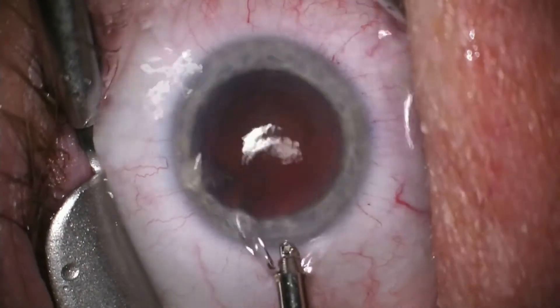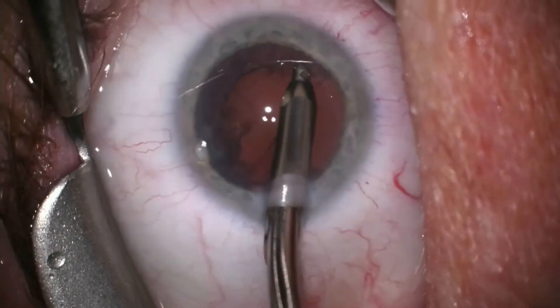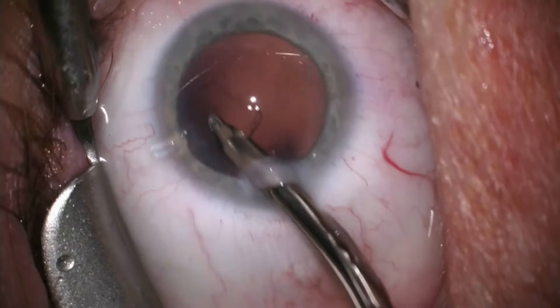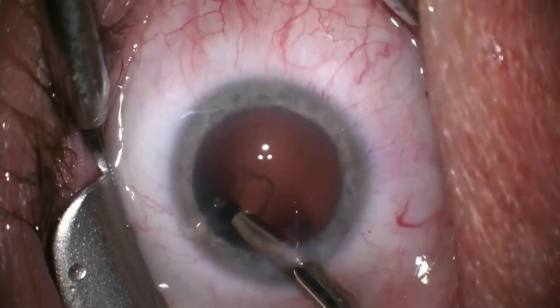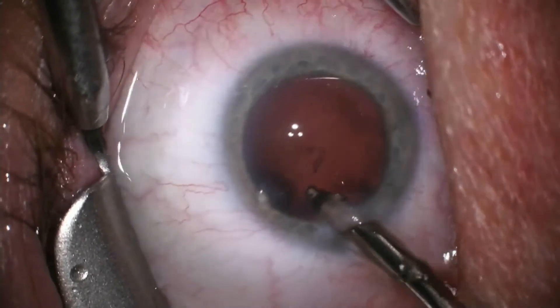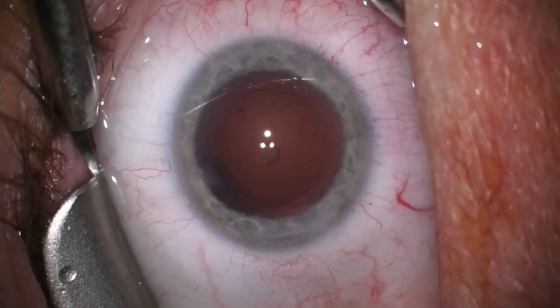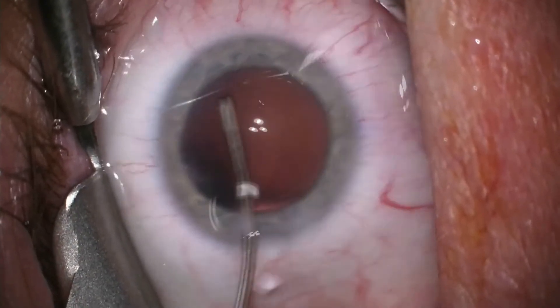While I am removing the cataract, our scrub technician is rolling up the lens implant and placing it within the injector to be implanted. The type of lens implant and its prescription was previously determined prior to the procedure during our office consultation. The cortex aspiration is now complete and the back capsule is carefully polished.